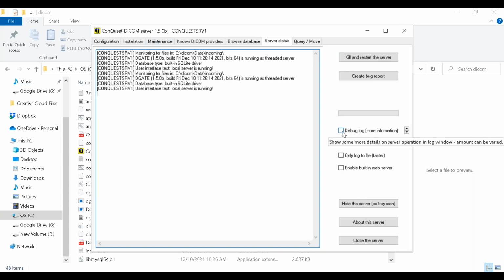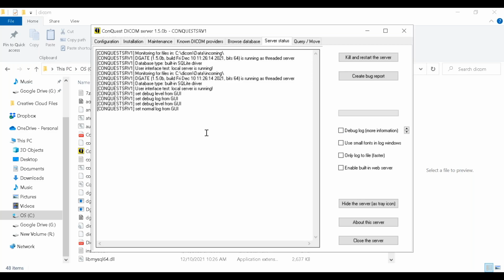Now, there's some options here in the log. There's like debug. Debug gives you, and it literally says right here, more information. Just in case you were confused, you get what debug does, right? Gives you more information, right? So anything that we do here is going to show up in this list. So let's look at this one.